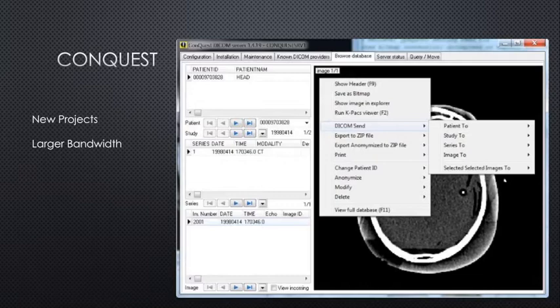Another issue that we have with this is that this is a one at a time process. So each patient, each study has to be de-identified separately. So while this has worked in the past, we've had to use quite a bit of man hours and even hire another FTE to handle processes like these, all these manual processes that we were unable to automate.